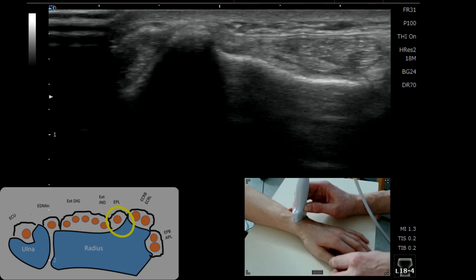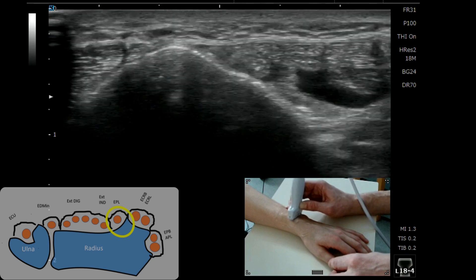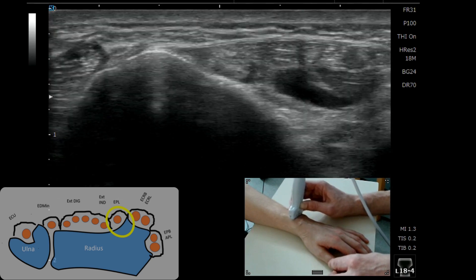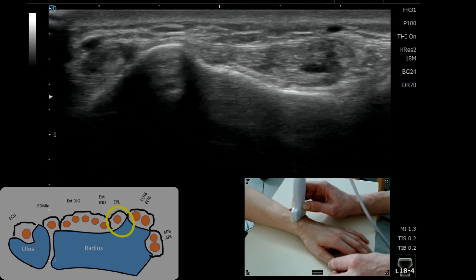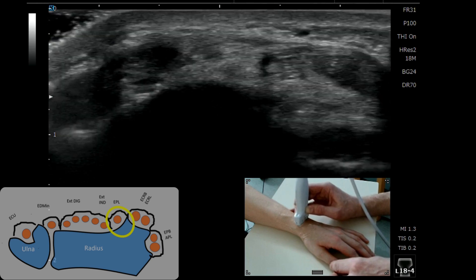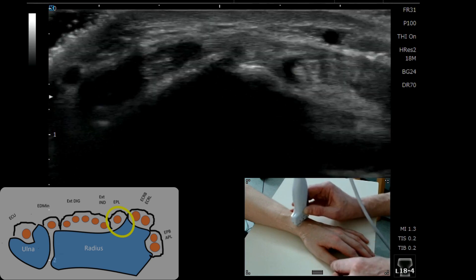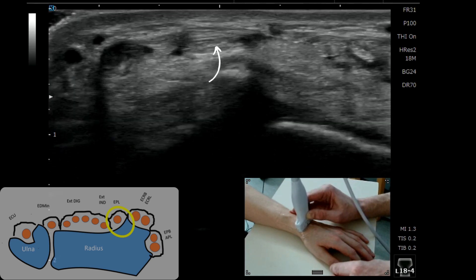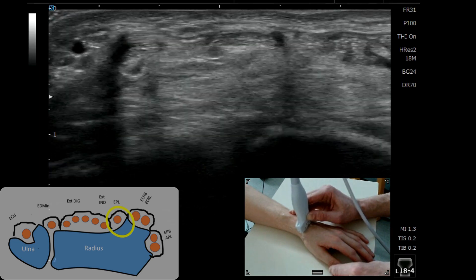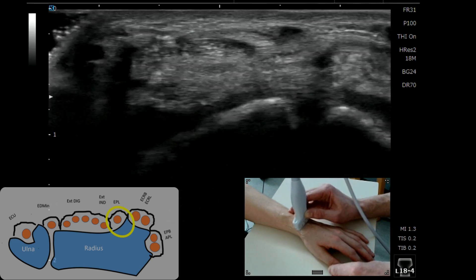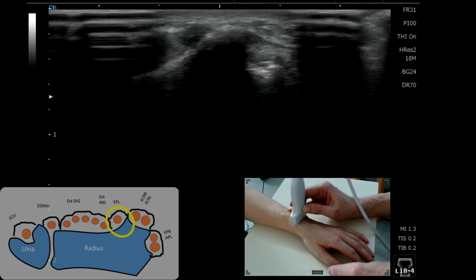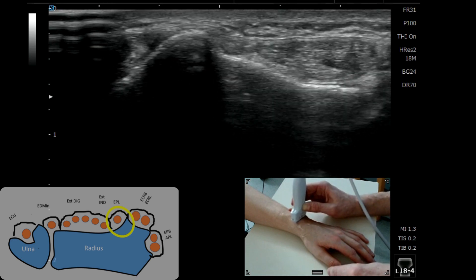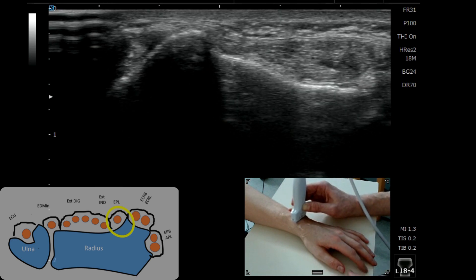If I wiggle the thumb you can see EPL just wiggling away there in that little dip. If you come up proximal you'll see it merge across, and if you come down a bit more distal you'll start to see it as it traverses across the top of the second compartment, and it comes back and flicks across into this little dip adjacent to Lister's.